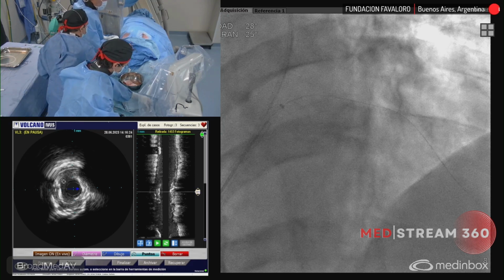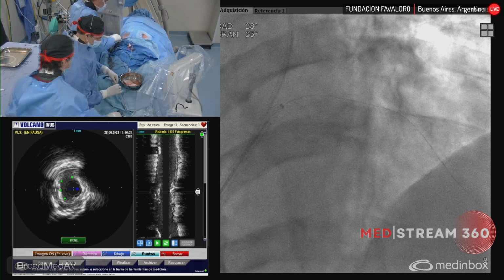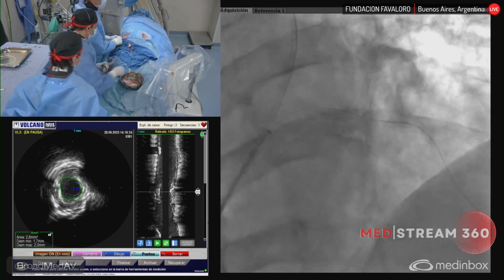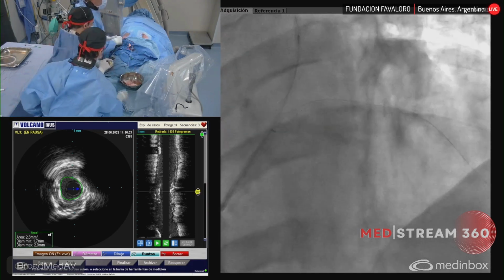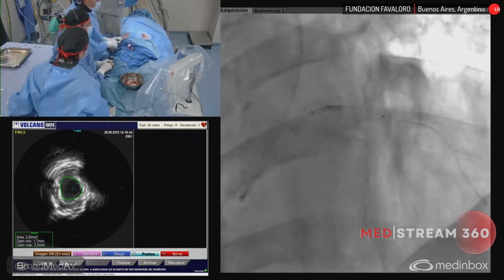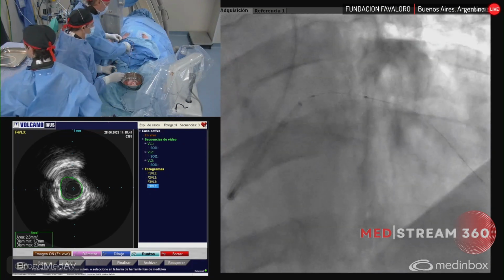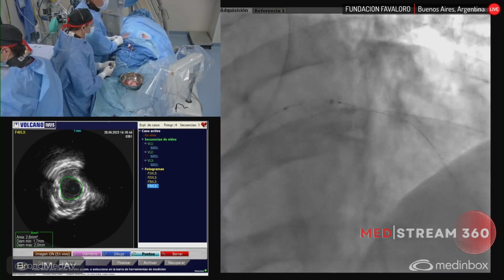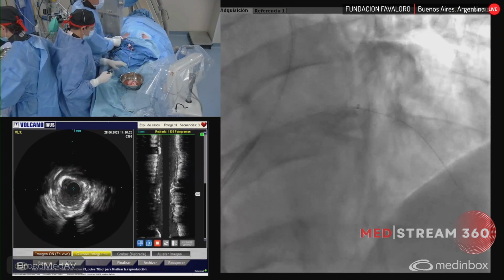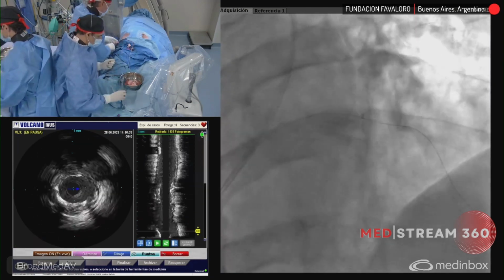Then I'm gonna use, if I have a 3.0 cutting balloon for the proximal calcified lesion, and then I'm gonna deploy the stent with the help of the telescope device. We can inflate there. We have the tight calcification, a 3.0 cutting balloon. Let me add, do you have the 3.0? Okay, so let's leave the balloon there. I'm gonna advance the telescope device, because the profile of the cutting balloon is absolutely worse than these balloons.